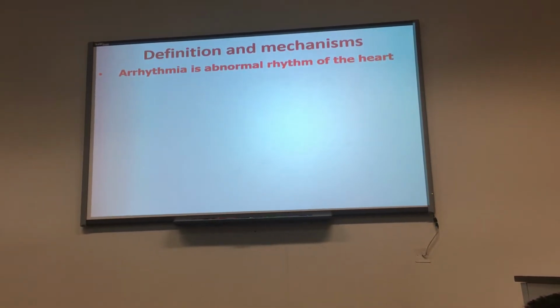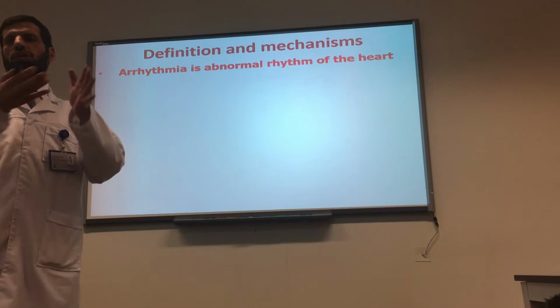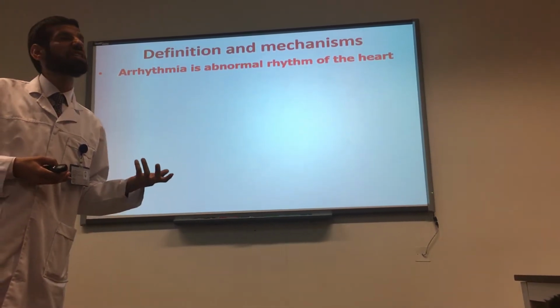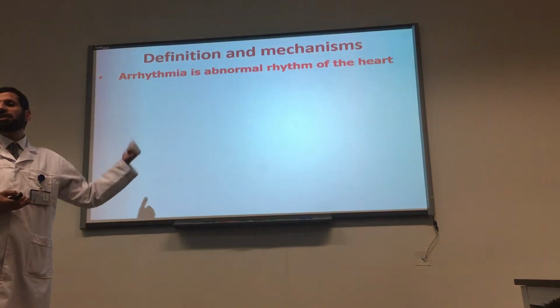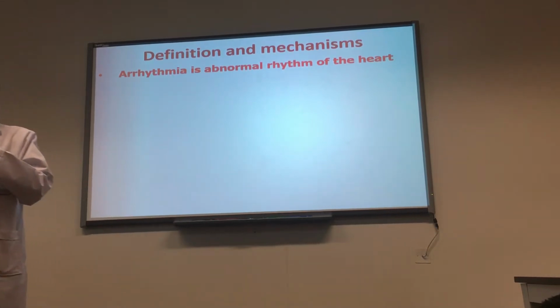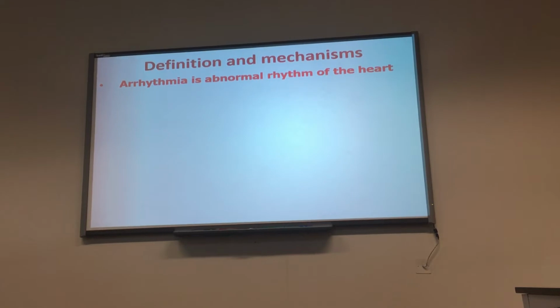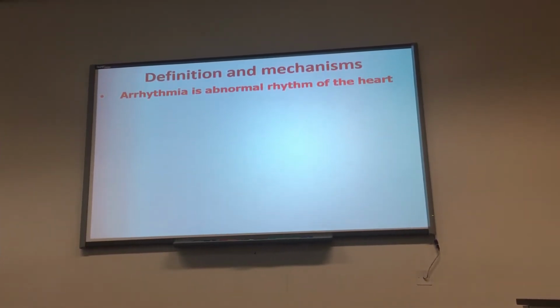Does every arrhythmia have clinical significance? No. If the rate is 55, most of the time the patient has no symptoms. We call it sinus brady, but there's no clinical relevance. If somebody is exercising with a heart rate of 110, is this normal or abnormal? Normal physiologically, but by ECG it is abnormal because it is above 100, as we said initially. So we'll say sinus tachycardia, but this is a normal physiological response to exercise. So not every arrhythmia is abnormal, and we'll see examples of that.